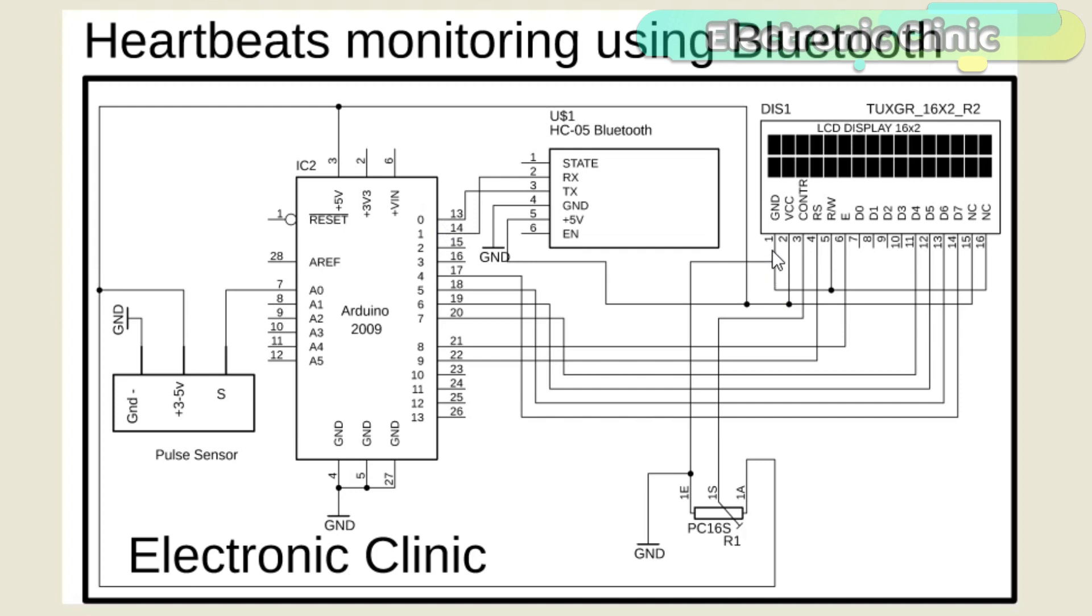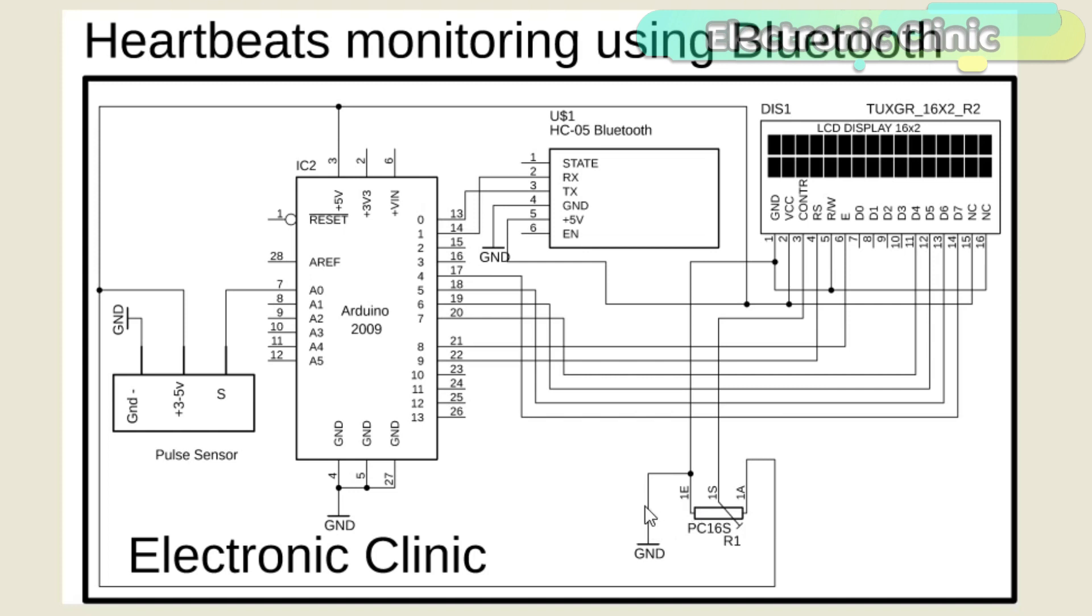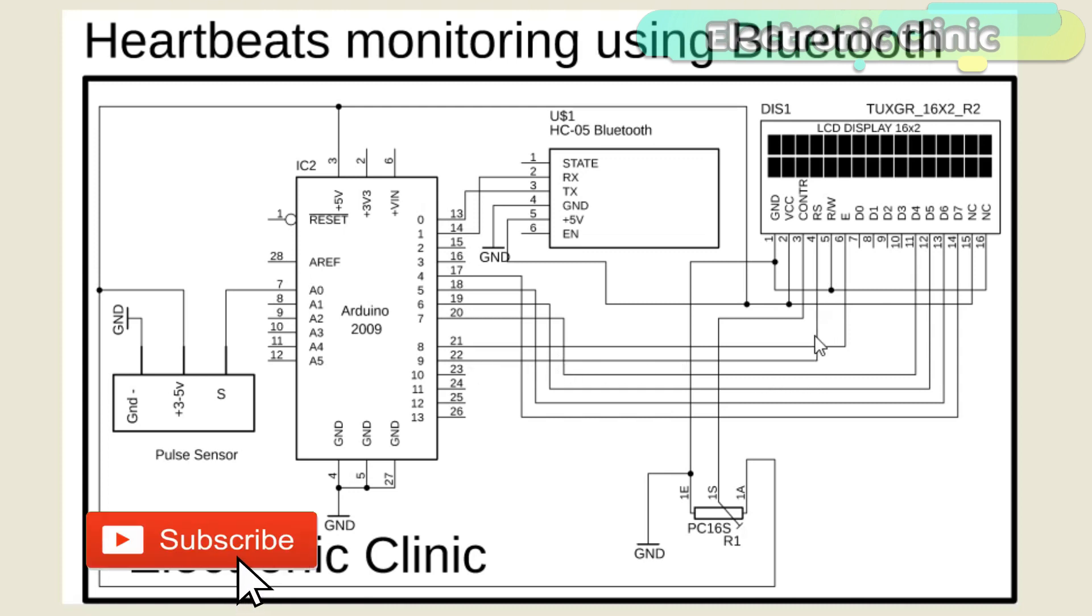As you can see, the ground is connected with pin number 1, 5 and pin number 16. 5V from the Arduino is connected with pin number 2 and pin number 15. The middle pin of the variable resistor or potentiometer is connected with pin number 3 of the LCD, while the other two pins are connected with the ground and 5V. Pins 4 to 7 of the Arduino are connected with pins D7 to D4 of the LCD. Pin number 8 of the Arduino is connected with the enable pin of the LCD. Pin number 9 of the Arduino is connected with the RS pin of the LCD.